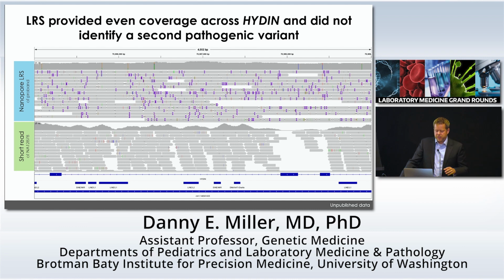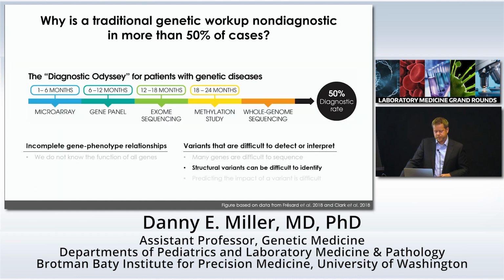This isn't a pathogenic change, but it's just a good example. Over this exon right here, she has a heterozygous polymorphism. So she does have some type of variation here that wouldn't be captured with short-read sequencing and could be informative. But in her particular case, we didn't find a second variant. We did confirm this with an orthogonal study that confirmed our genetic results.